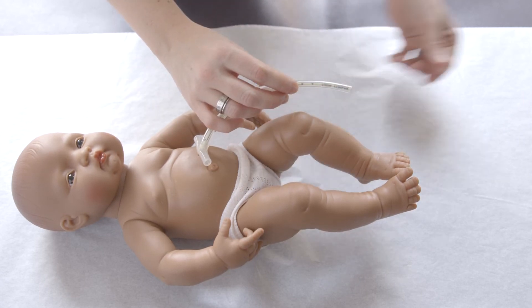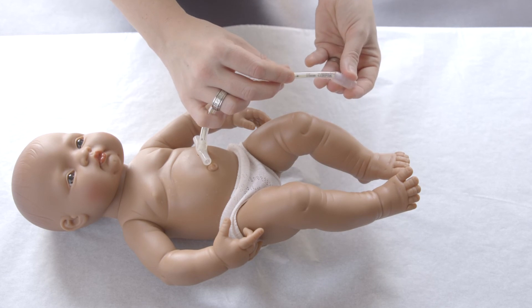Step 8: Replace the skirt. Make sure the narrow end is closest to the clamp.